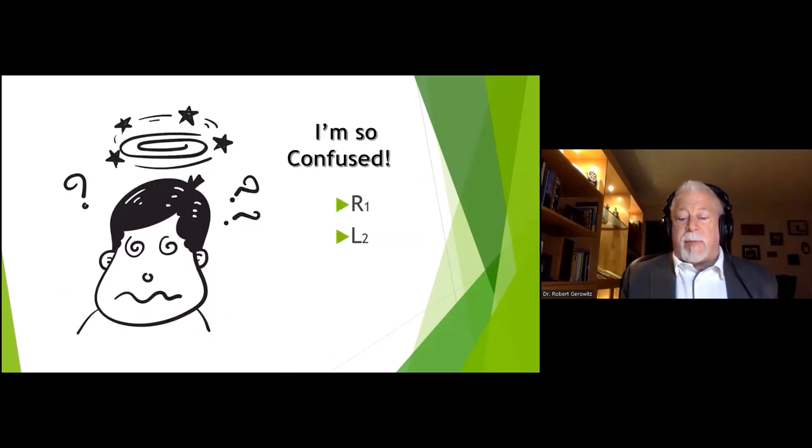Now, the next thing that can happen is that you have your patient there, and they let you know that they broke their newer right mold, and they broke their most recent backup right mold, and now they're wearing one from, they think, 2 years ago. And just like fitting soft torics, this can all get confusing in a New York second. So what I've done since the beginning is I label each order with subscripts like R1, L2, depending on which number I'm ordering, and the order dates to keep it all organized. So the more organized you are in your record keeping, the easier it is to troubleshoot issues.